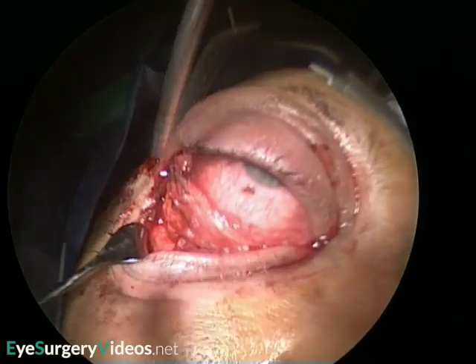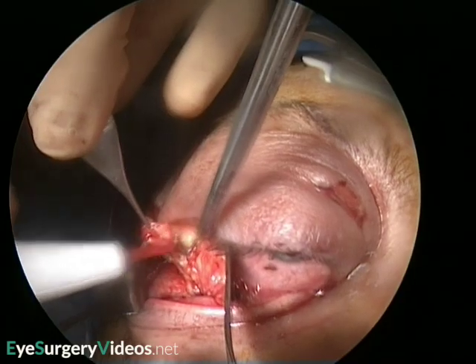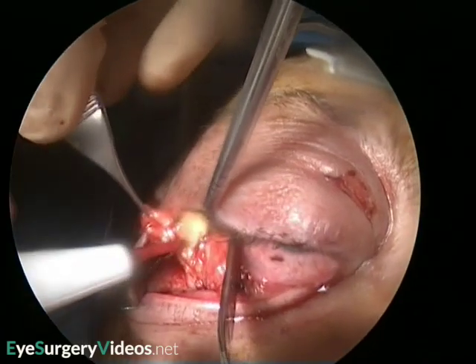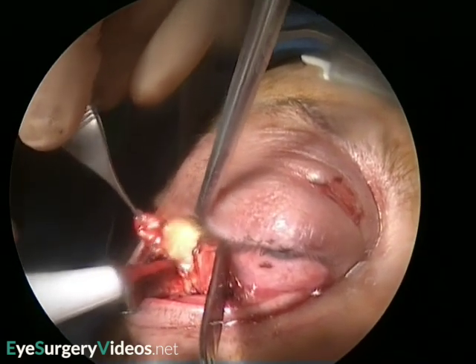The lateral fat pad is gently teased out and excised. It is divided from the medial fat pad by the arcuate expansion, which is carefully preserved. The middle fat pad is also teased out and excised, taking great care of the inferior oblique muscle between it and the medial fat pad.